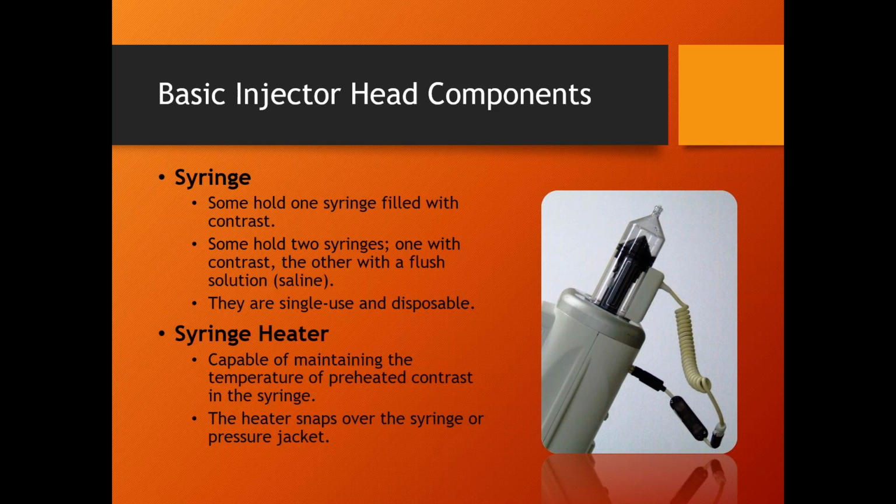So that's 2 injections, but one click of the button, we can send them both. Each one, my first phase is green, flow rate of 5, a volume of 20. Second phase is going to be the blue fluid. They're both clear, but the blue side, which is the water, the saline, flow rate of 5 and 20. So while this is 1 injection, it's a 2-phase injection.